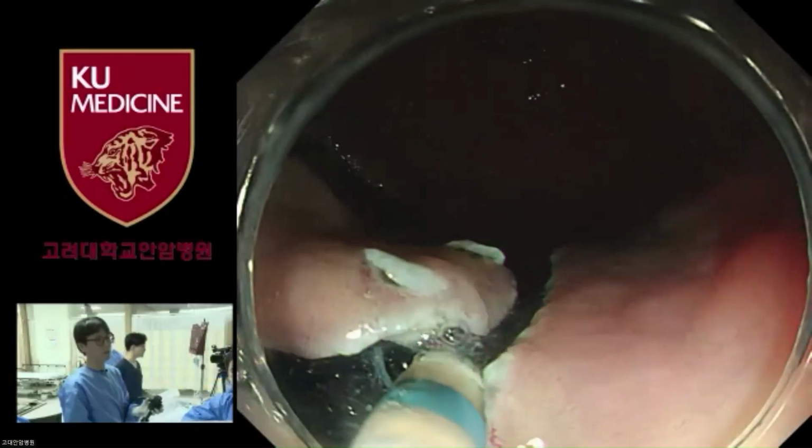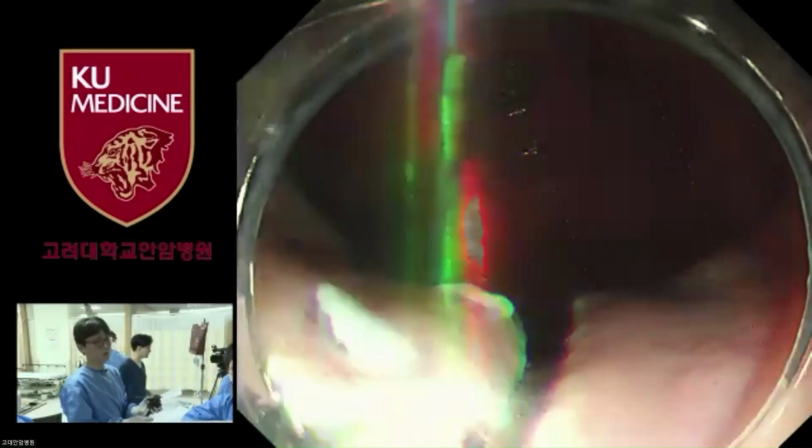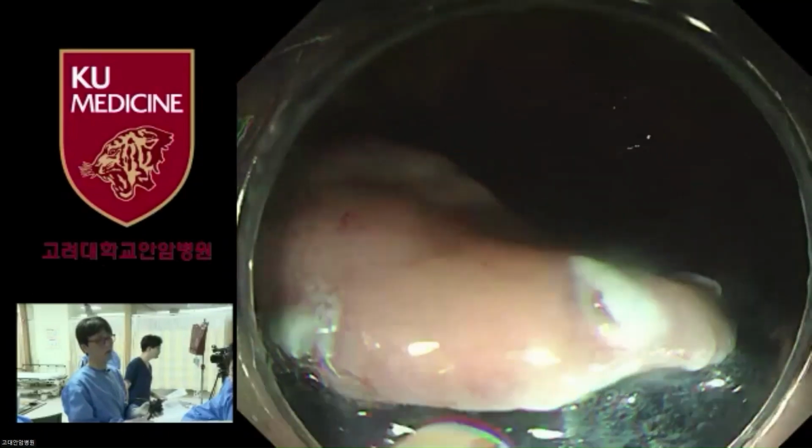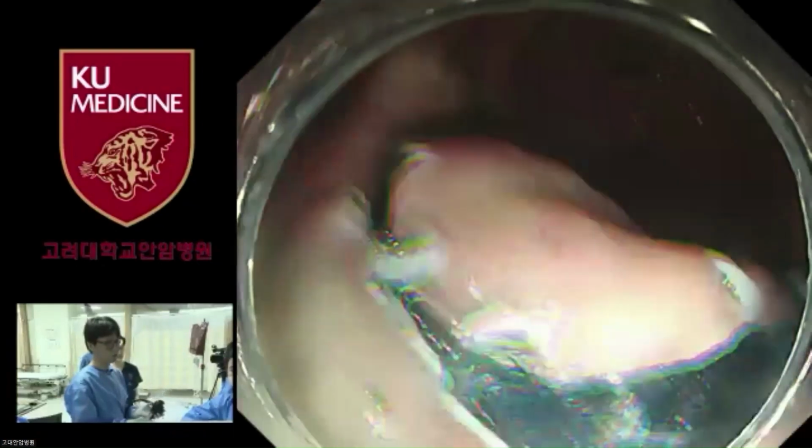What setting are you using now for this section? You mean the Swift electrosurgical unit, right? Yes, we use Endocut I mode for cutting and Swift Coag for coagulation. What effect? Is it effect 4?